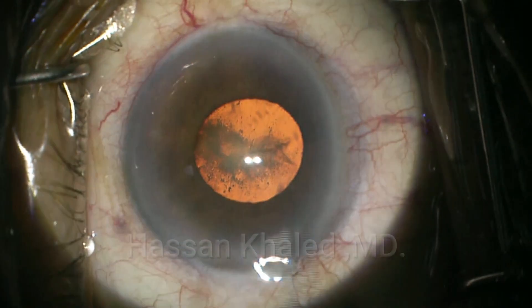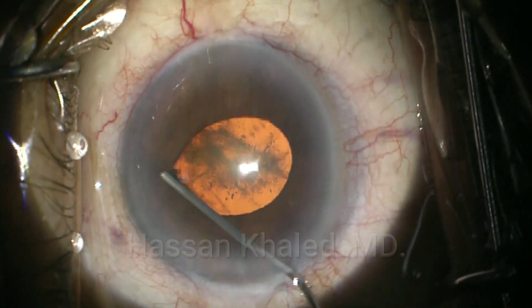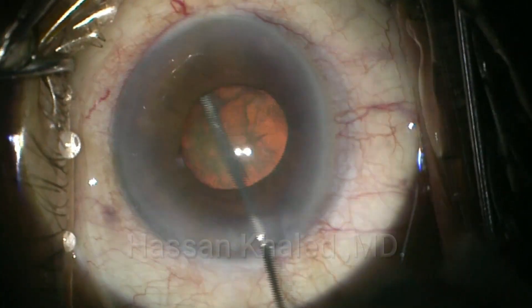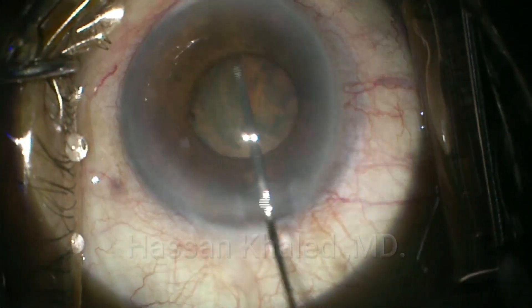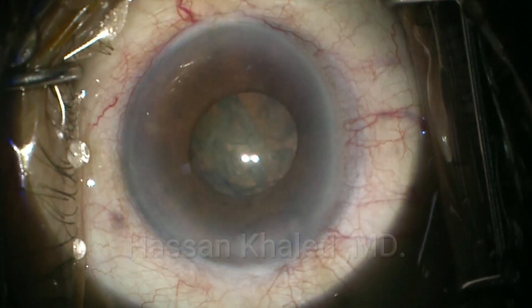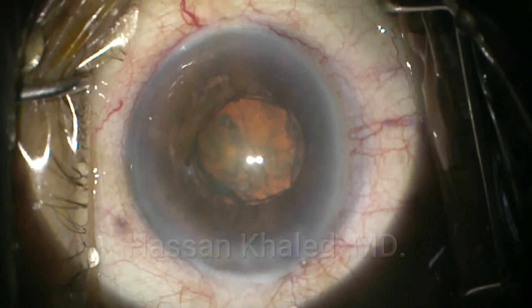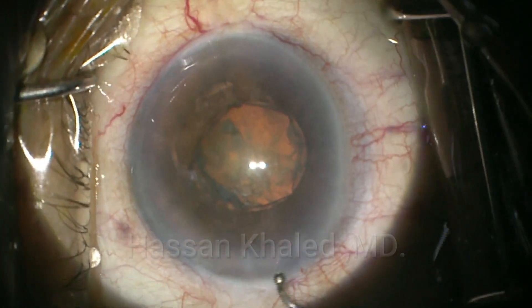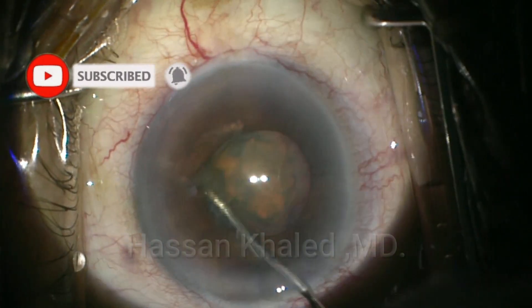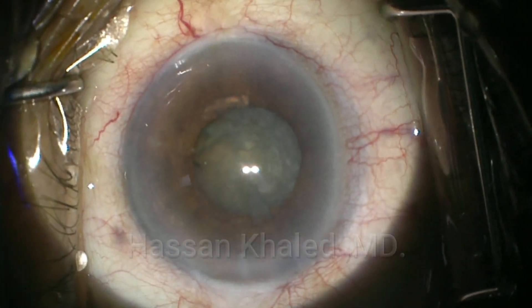Then empty the anterior chamber from the viscoelastic. Test the cannula before doing the hydrodissection — you can push the iris to see the edge of the rhexis. You can see a complete posterior wave during the hydrodissection. This is a very important step in vertical chop to be sure that hydrodissection is complete, and to confirm this, it is important to rotate the nucleus. You can see the rotation of the nucleus.